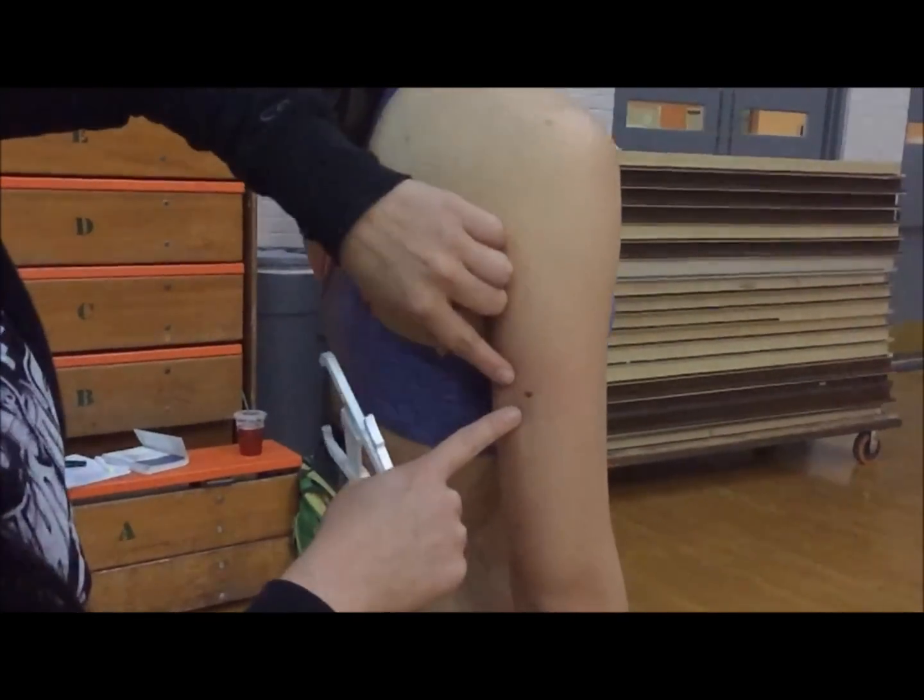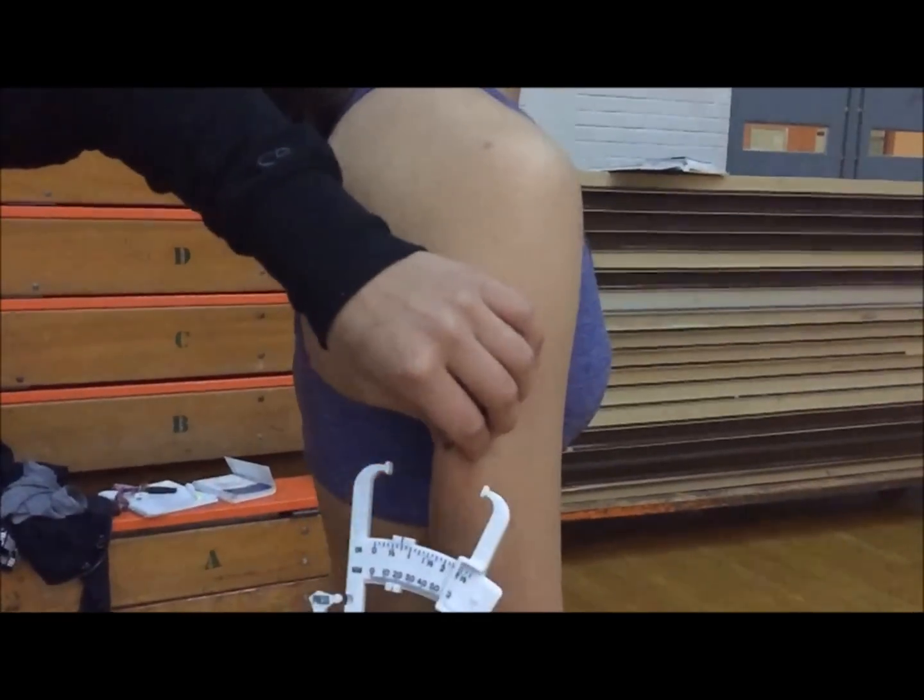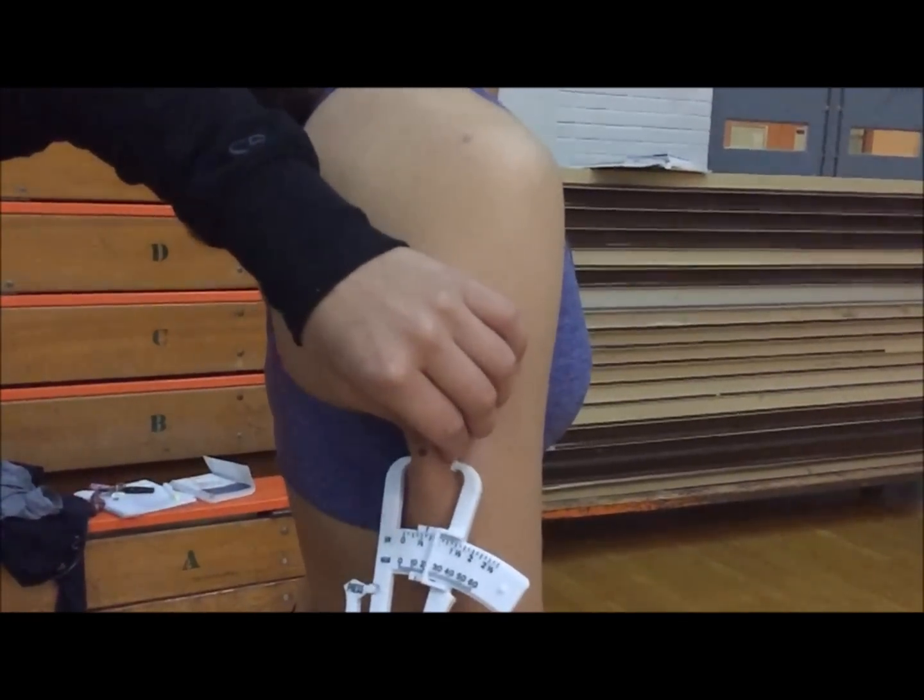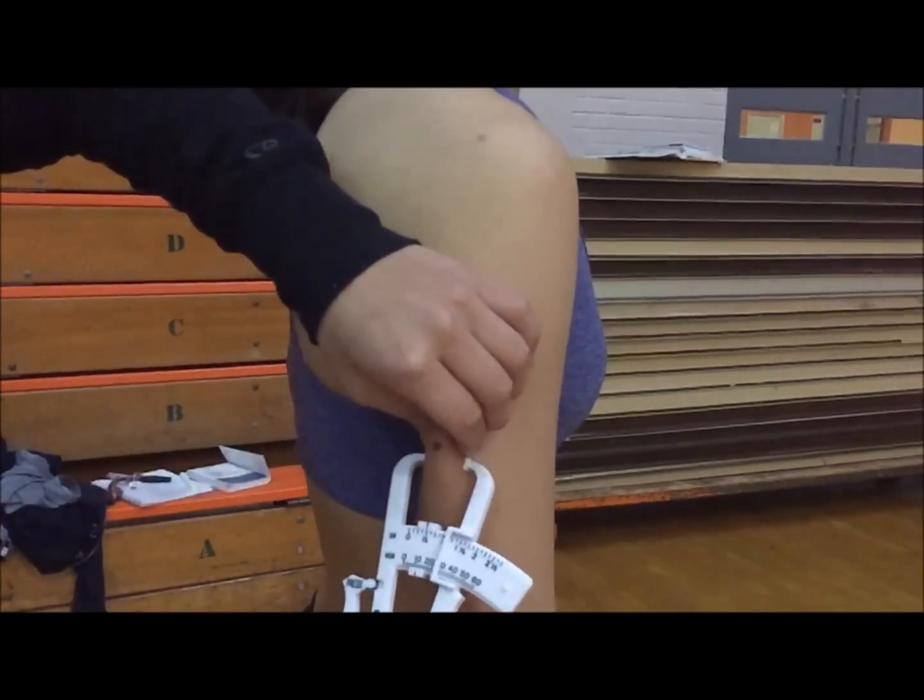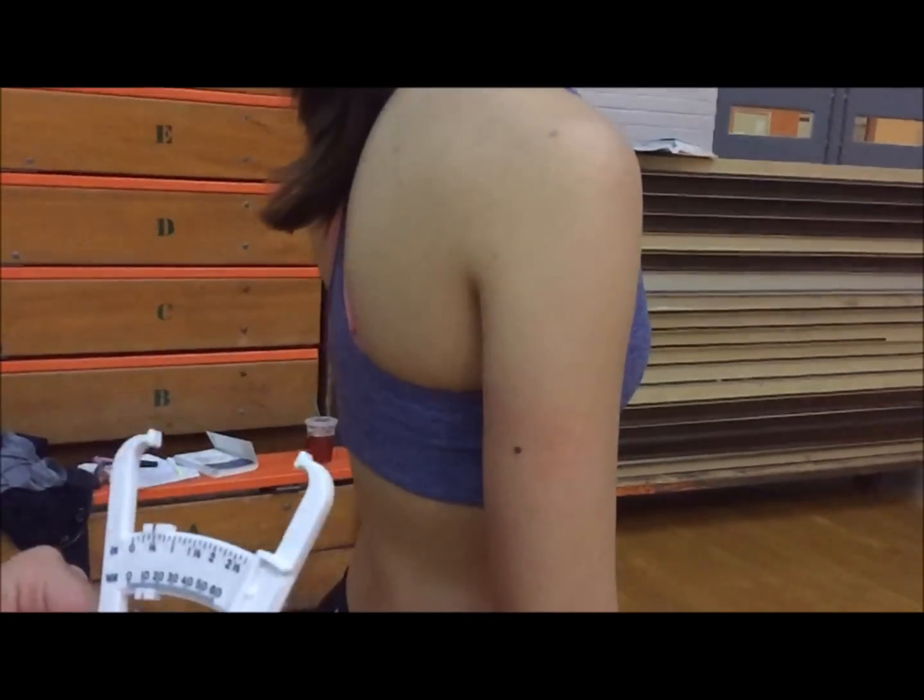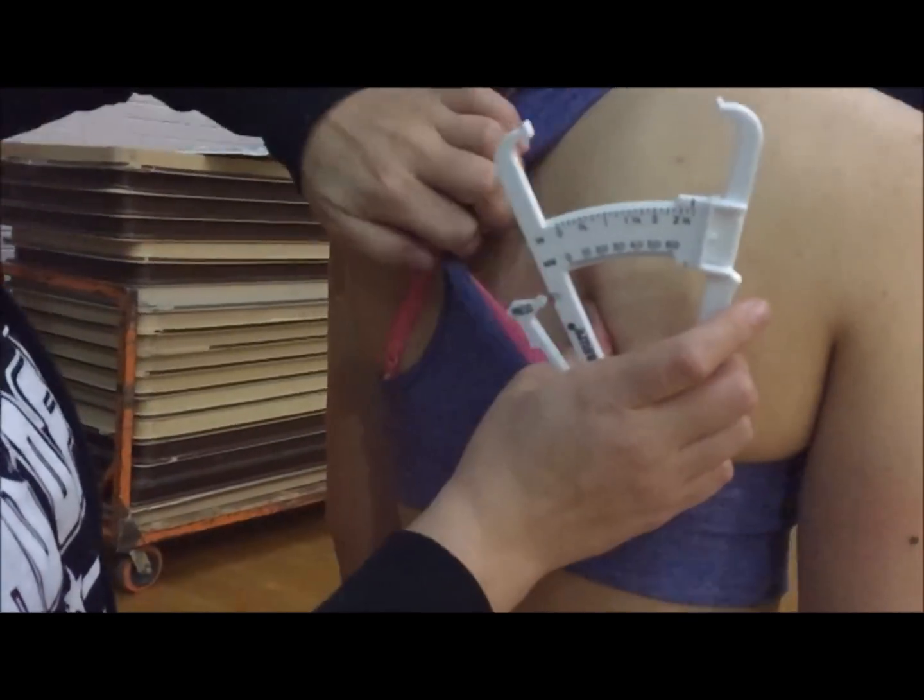We will now be taking the skinfold measurements. With the tricep, make sure that you have a vertical fold and that you are separating the skin from the muscle. Make sure that you place your caliper back at zero for the next fold.